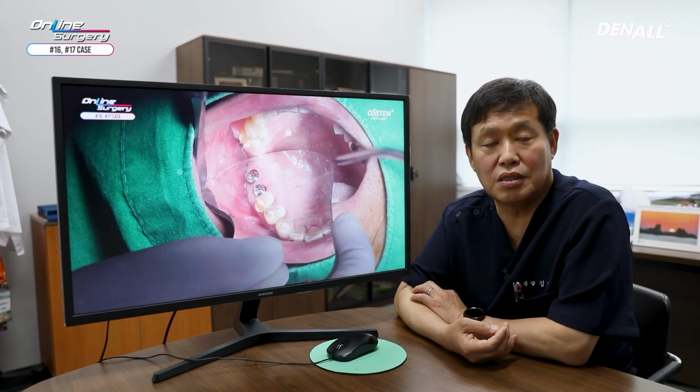I hope this video was of help when you use a OneCAS drill or OneCAS kit.